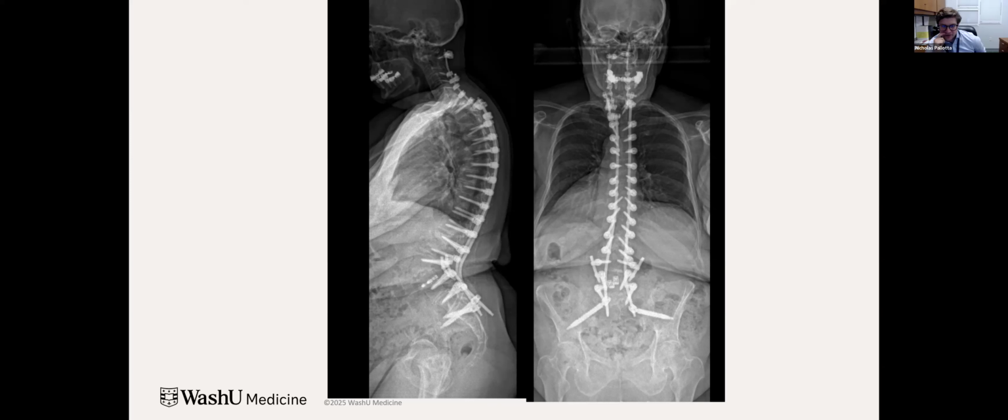So what I do at the PSO site is use the monoaxial function so that as long as the screws are fairly parallel to the end plates, I can actually use that as the template as I reduce that. So as they're tightened, they're basically showing me the angle. And then I know that I'm pretty good with the sagittal plane within a few degrees probably. And then place the long rod to get the global alignment right. I see.